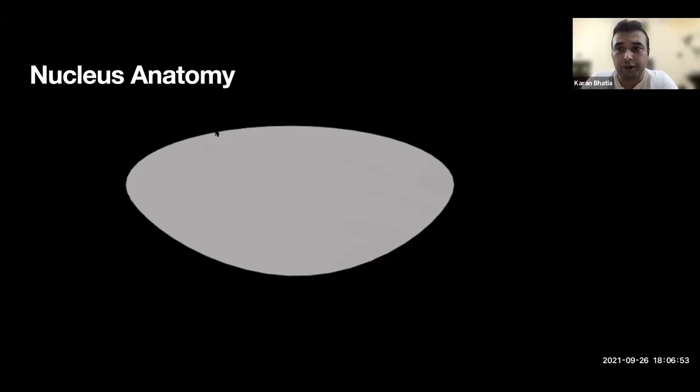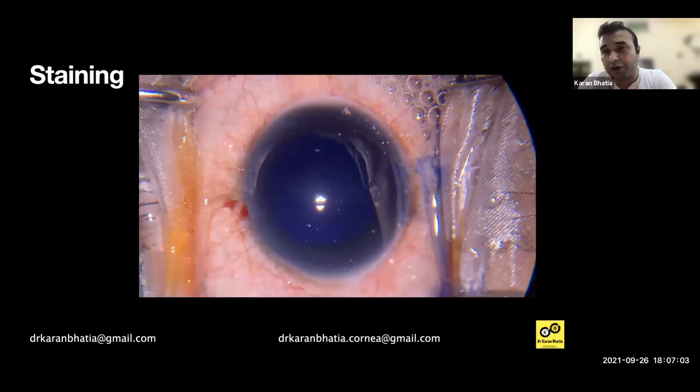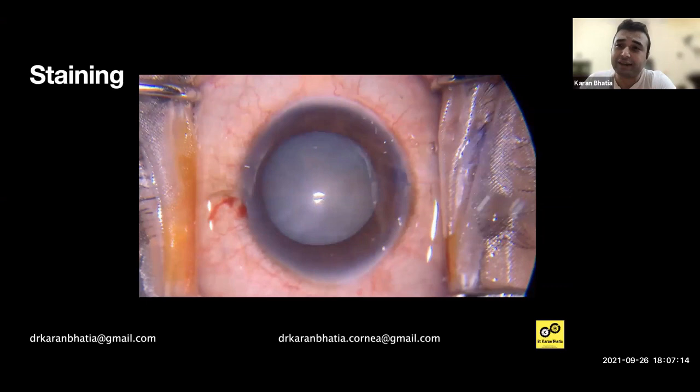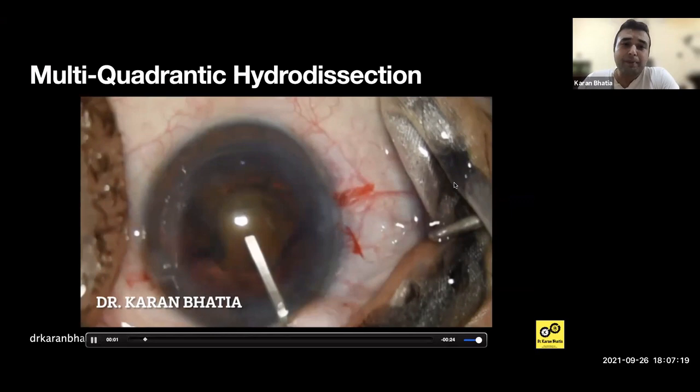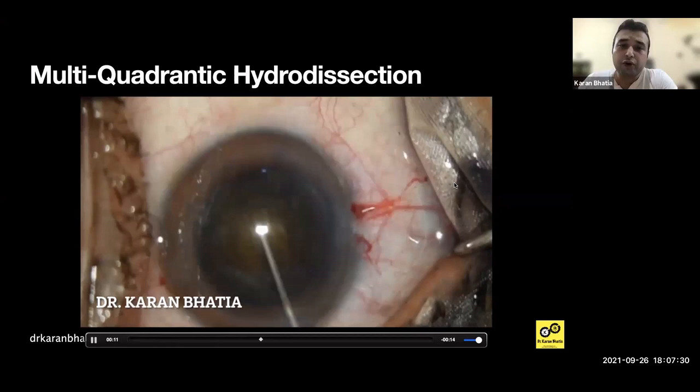Capsular staining is extremely important here because of poor visibility. Use Trypan Blue, keep it for a good amount of time — particularly if you are just starting out, stain a little longer, then wash nicely. If the pupil is not completely dilated, use adrenaline to dilate it. Another important step is multi-quadrantic hydrodissection — go to multiple places and then tap in the center; otherwise you risk breaking the zonules.